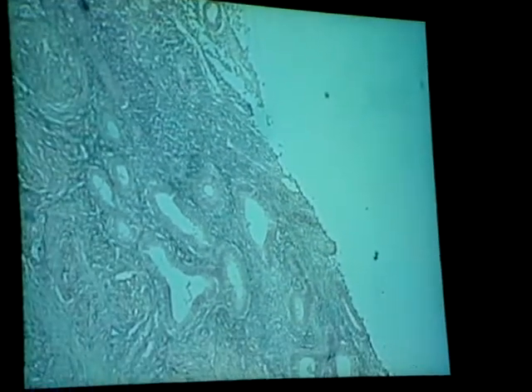So look for the blood for the menstrual stage. What are you looking for in the secretory, the pregravid stage? Squiggly, shredded uterine glands. And for the proliferative or follicular stage? Normal, smaller, rounder glands, no blood, no squigglies.